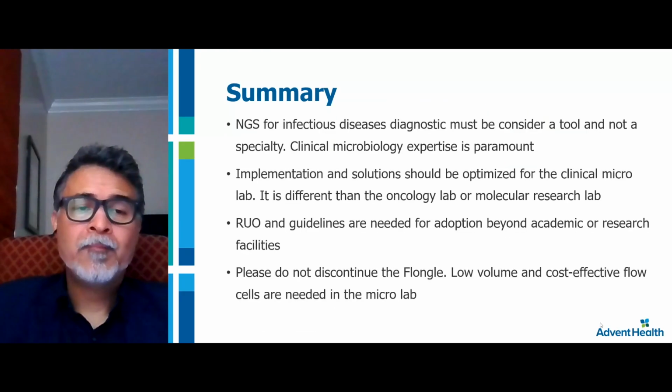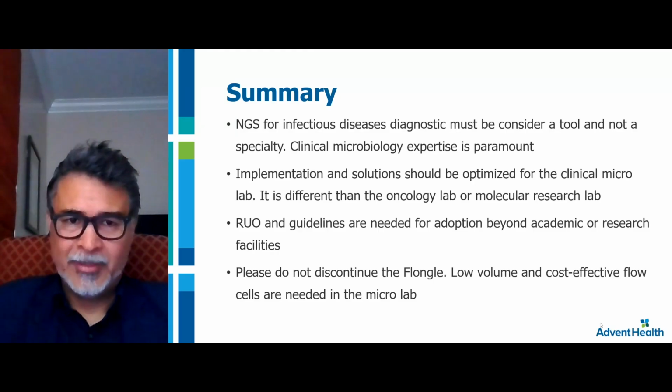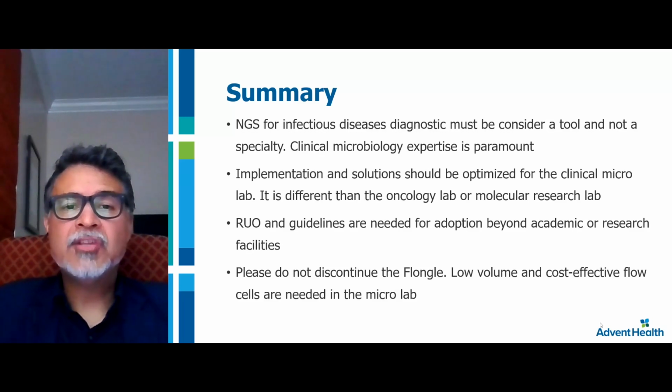So in summary, NGS for infection disease diagnostic must be considered a tool and not a specialty. Clinical microbiology expertise is important. Implementation and solutions should be optimized for clinical microlab. It is different from an oncology laboratory and molecular research lab. The flow of samples, the complexity, and the time that is required for this result to be back are critical. The research use only and guidelines are needed for adoption beyond academic and research facility.